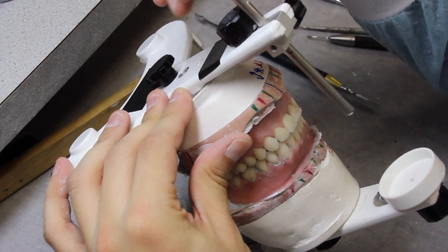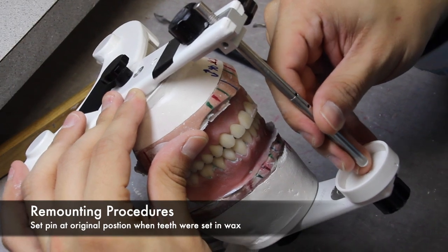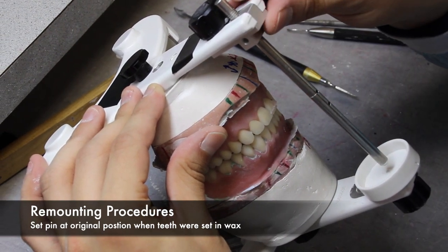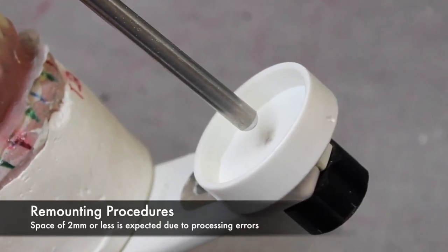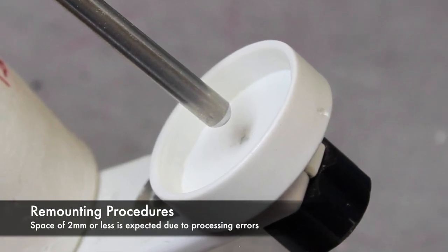When remounting, be sure that the incisal guide pin is in the original position when the teeth were set in wax. Usually the pin is at zero. With the pin in its original position, it is common to see the pin off the table. A space of 2mm or less is expected. Anything more, consult with the dentist.